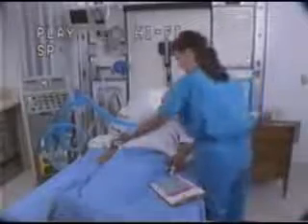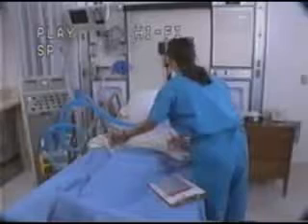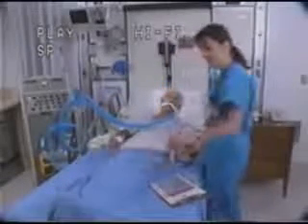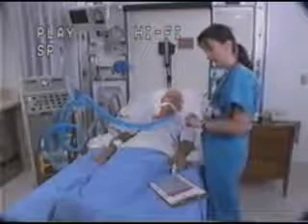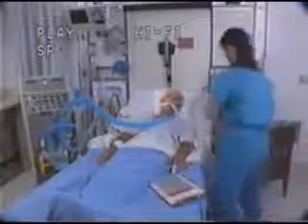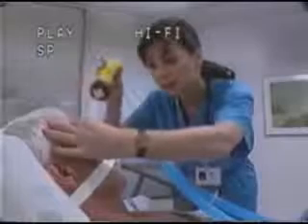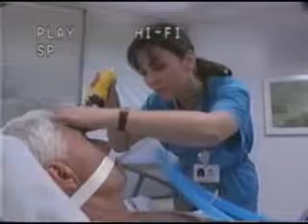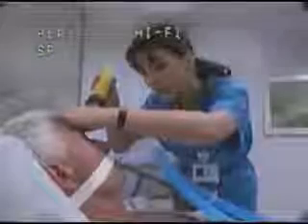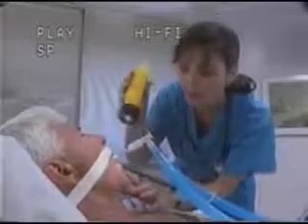First, the critical care nurse assesses the patient's level of consciousness. Any change can be an early sign of hypoxemia or hypercapnia. If the patient is anxious, confused, or agitated, the nurse may suspect hypoxemia. If he's sleepy, it could be hypercapnia. This part of the assessment is particularly challenging in that the patient has an endotracheal or ET tube through his vocal cords and can't speak. Can you open your mouth so I can check your mucous membranes?